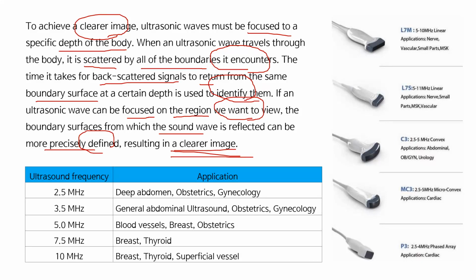So we have to focus ultrasonic sound on the region we want to view.